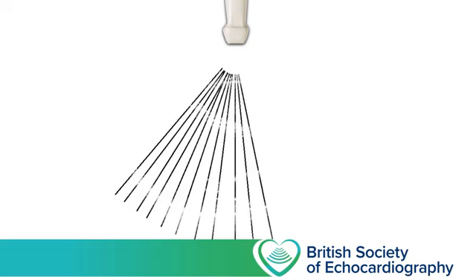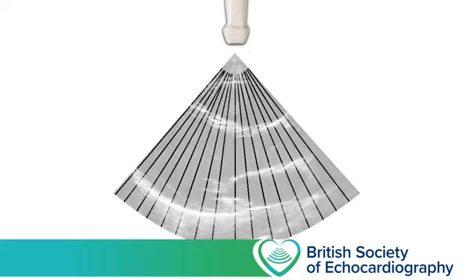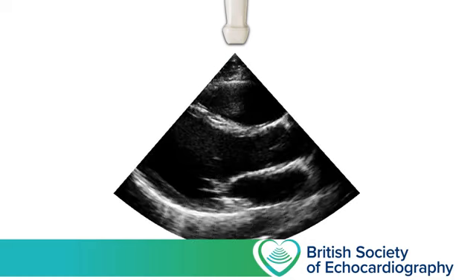So to generate our 2D image, we're going to create multiple one-dimensional lines of information that fan out from our probe. These scan lines, which fan out from a probe, run not quite parallel to each other, such that they're closer together in the near field and spaced further apart in the far field. The ultrasound software then uses an averaging process to fill in the gaps between the lines. So you can see how having a greater number of lines will increase your resolution, as there will be less requirement for the averaging process to fill in the gaps.